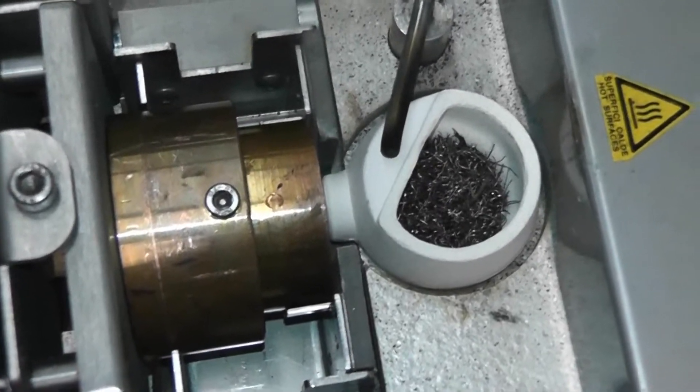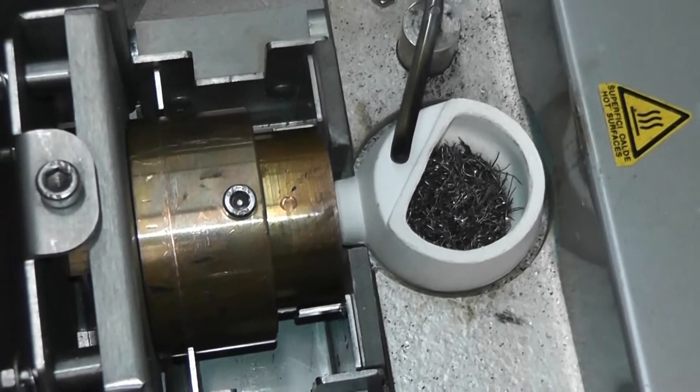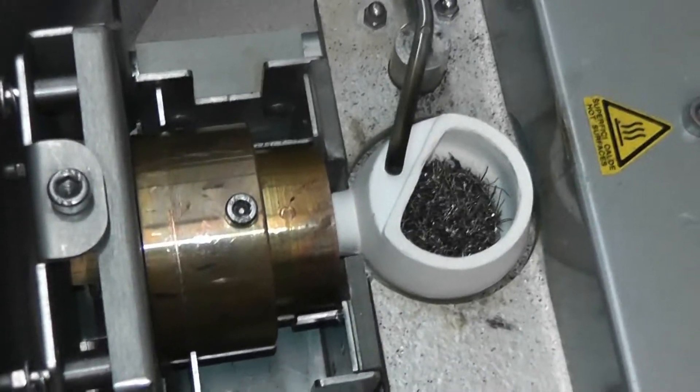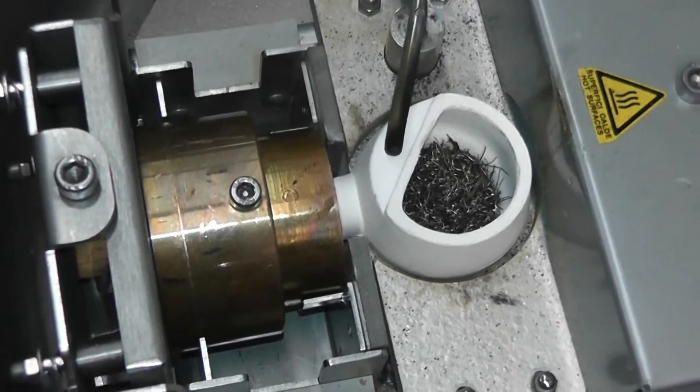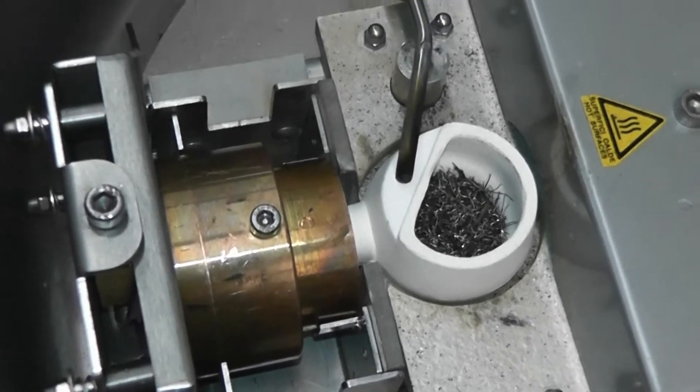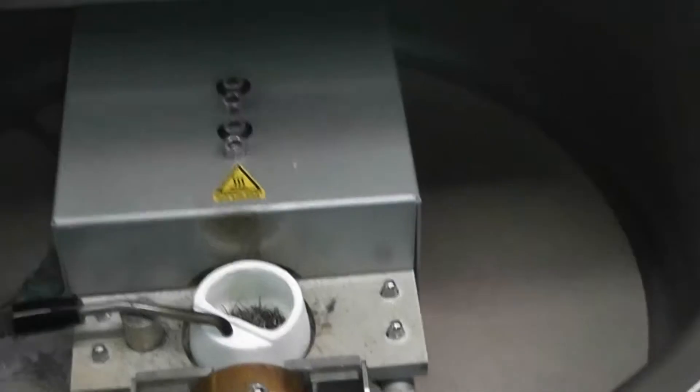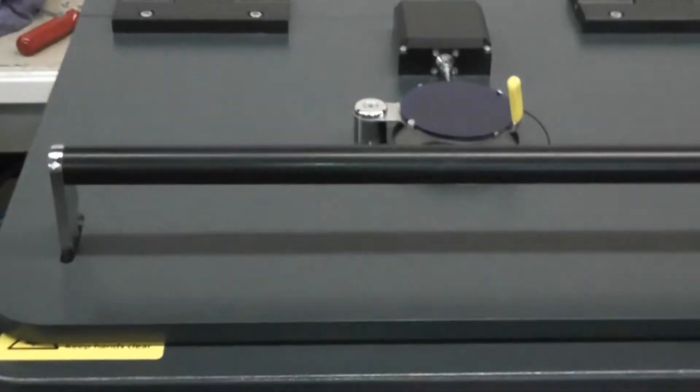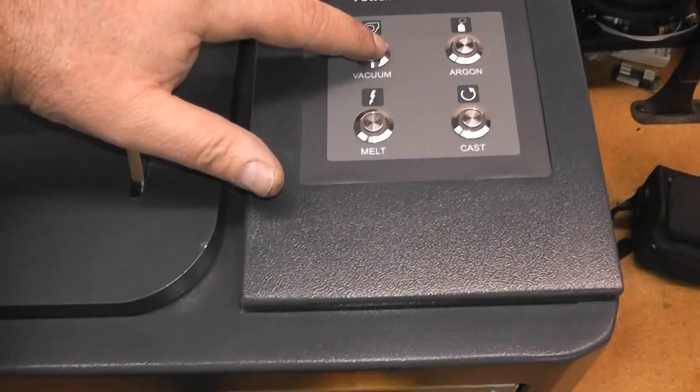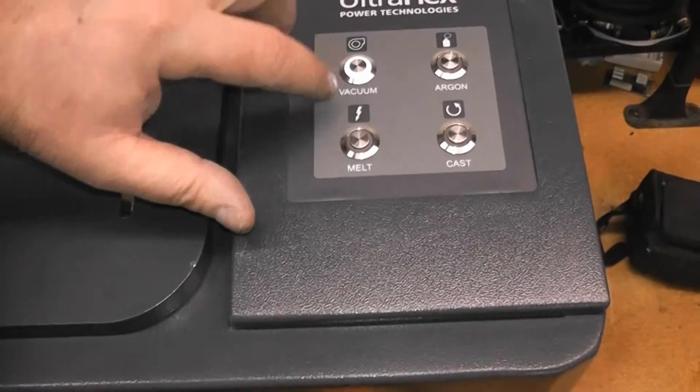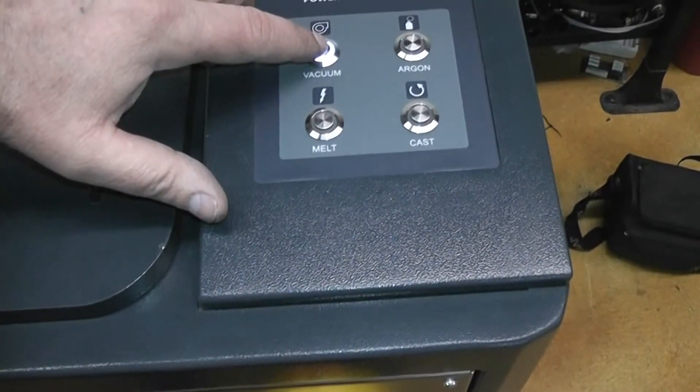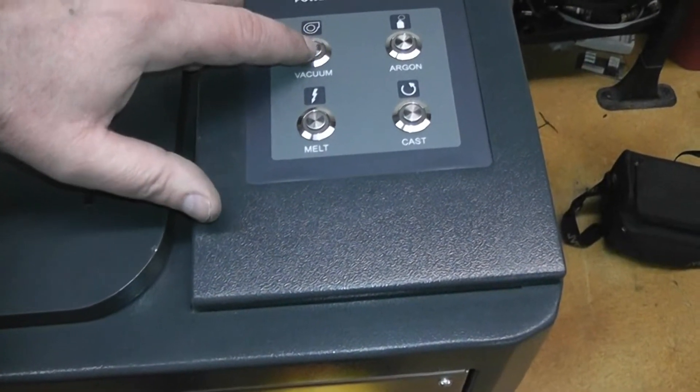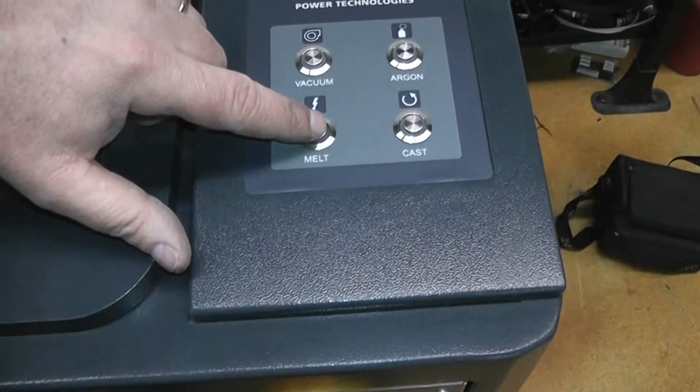The material has been compressed and has been loaded into the centrifugal arm along with the ingot mold. We will now close the lid and pull a vacuum. The vacuum is now being pulled. Now that we have a vacuum, we are going to press power to start the melt.